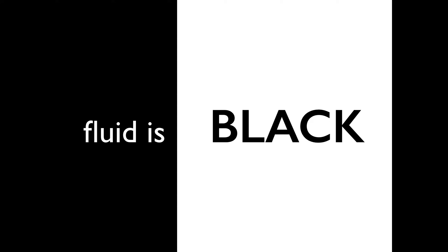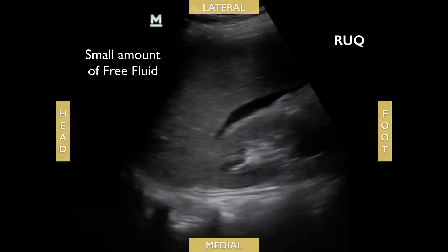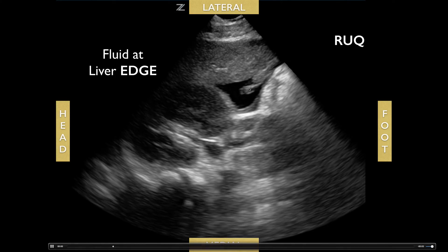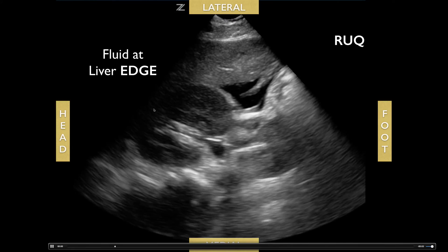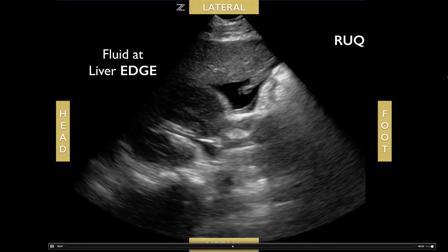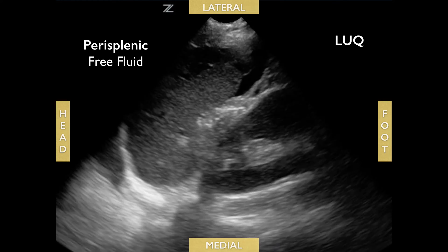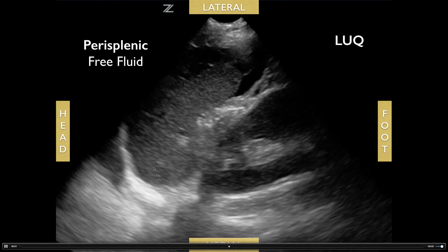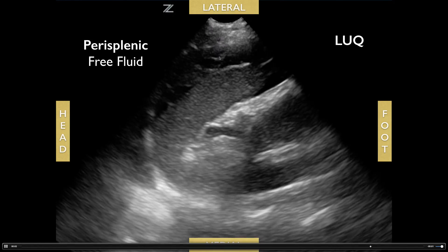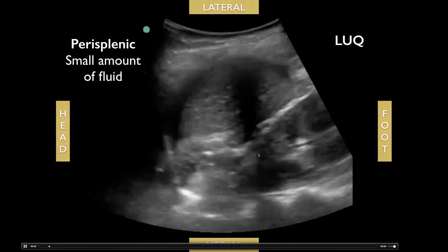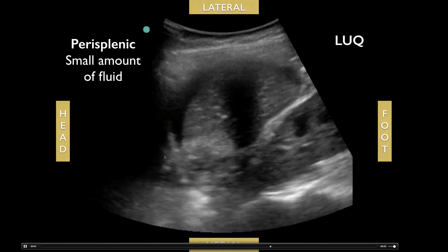Remember, fluid is black — we're ruling in or ruling out any abdominal fluid. Here's a patient with a small amount of free fluid between the liver and kidney. Here's a patient with fluid at the liver edge but no fluid in Morrison's pouch, suggesting a lower abdominal bleeding source. For the left upper quadrant, you can see anechoic area around the spleen or between the spleen and diaphragm, not between the spleen and kidney.